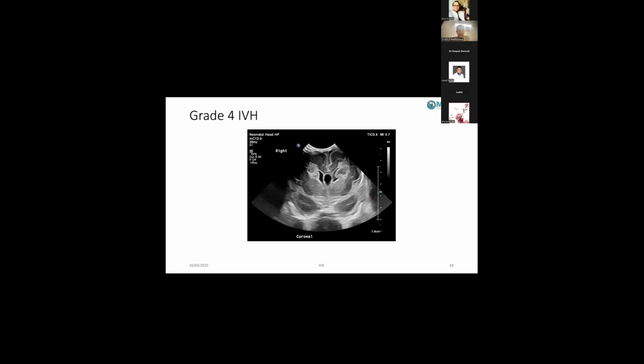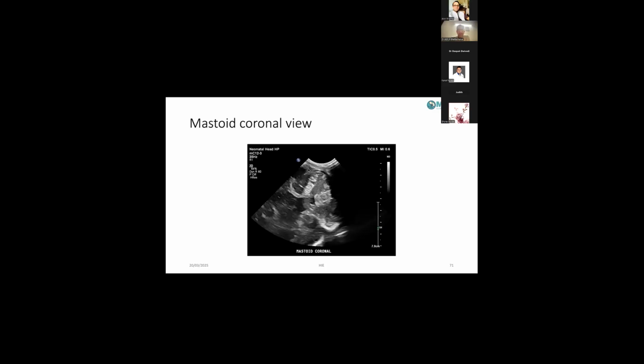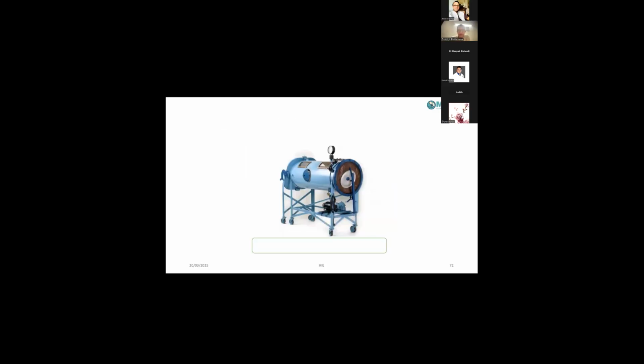Right. In the interest of time, I'm just going to skip this, and Alok can take up all this with you in his next sessions. Last one, promise, guys. What is this?